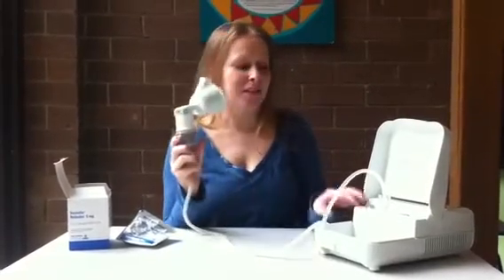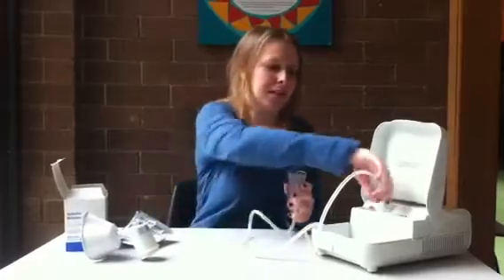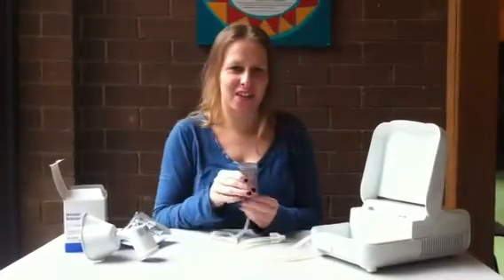When you're done, turn off the nebulizer and take apart the contents. Make sure you wash it thoroughly before drying it and storing it for next use.